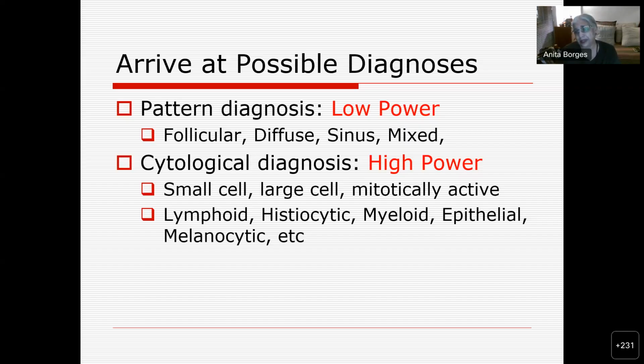Many of them are intermediate in size. I agree that diffuse large B-cell lymphomas are never small cell, but they are not necessarily very large, okay? So many of them are, but a whole lot of them are just intermediate in size. They're very high grade. They come into this group of large B-cell lymphomas, and I'm not going to talk a lot about it because you'll hear about it the next time.